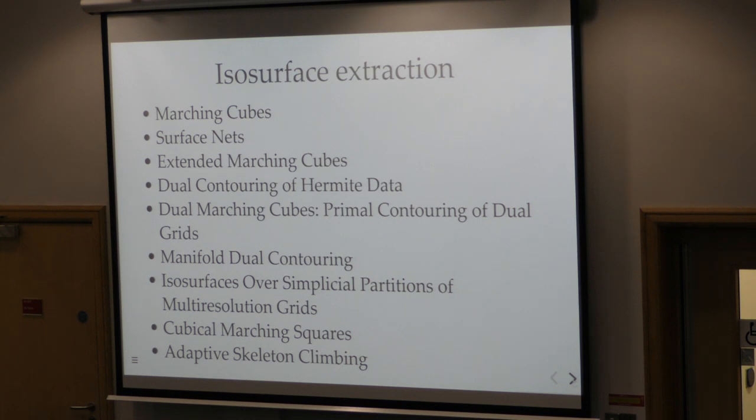Once other things like that are done, you have a mesh that is ready for printing, and it can be verified by software that correctly prepares a model for that process. Then it goes through the machine, and you get a physical thing like this, which then has to be post-processed by hand by someone. After that, that's the end result of all that convoluted process.